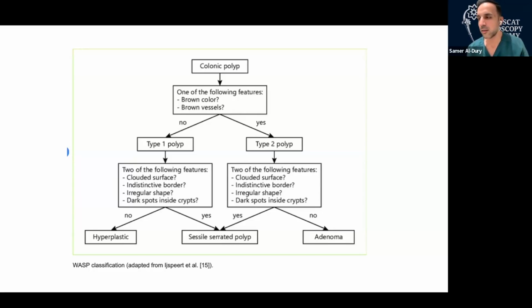From my practice, without having to memorize WASP all the time, the most effective, efficient way for me personally to find SSLs and big ones is usually just to look for the mucus and think logically.